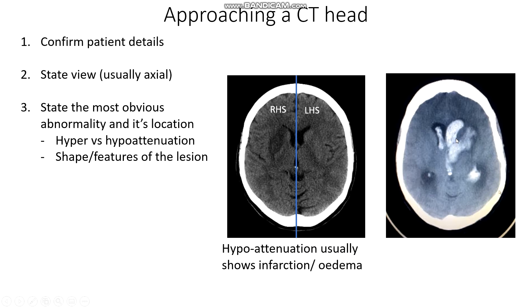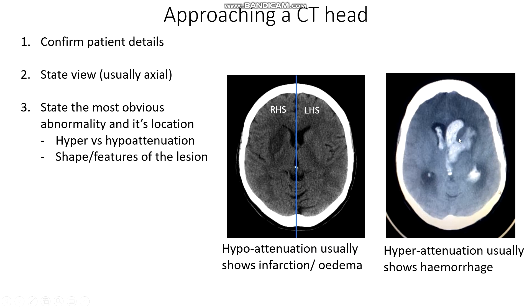Usually hyperattenuation on a CT scan shows acute blood or a hemorrhage. And in this case, the blood has actually spilled from the brain parenchyma into the ventricles, which is why it looks like this shape.